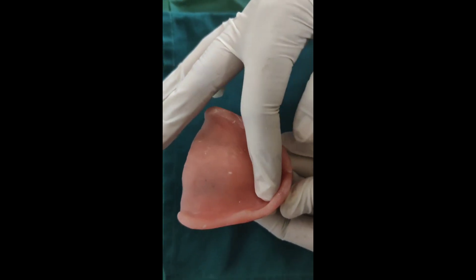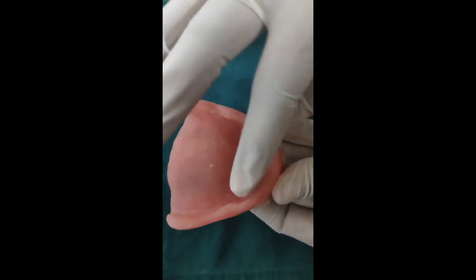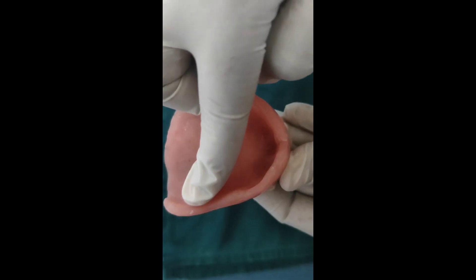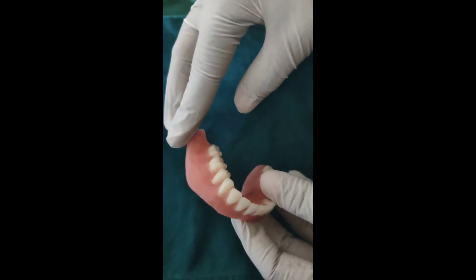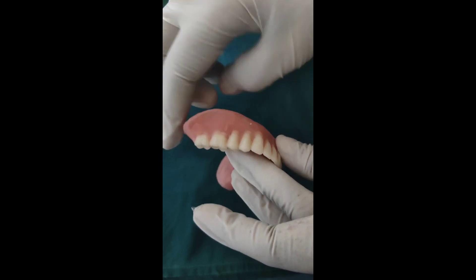The maxillary complete denture should be evaluated all over on the polished surface and also the intaglio surface of the denture. The polished surface and the intaglio surface should be palpated with the index finger, running all around the intaglio surface to check for any irregularities or nodules, which should be trimmed.